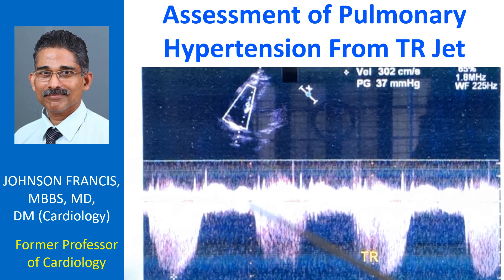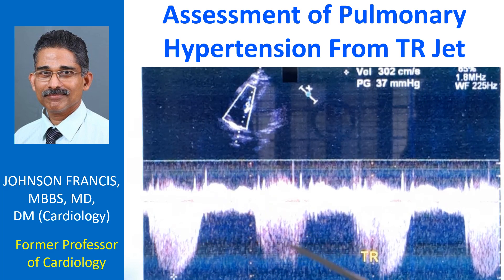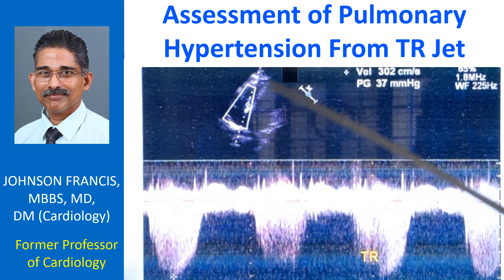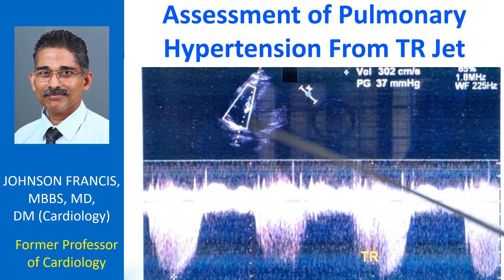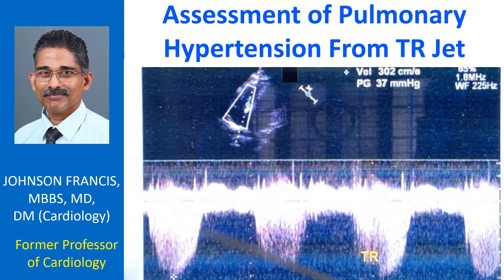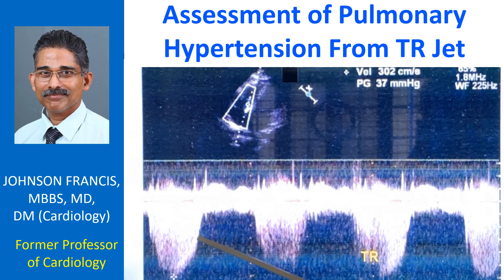This is a continuous wave Doppler jet in tricuspid regurgitation. You can see this is an apical 4-chamber view and the cursor can be seen passing across the tricuspid valve region. This is a full jet, very clear jet, tongue-shaped jet.